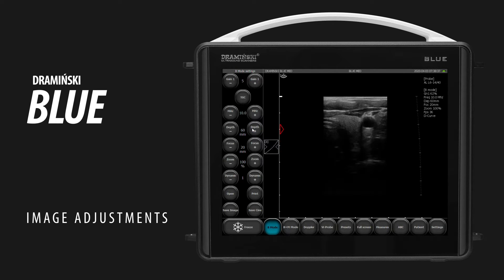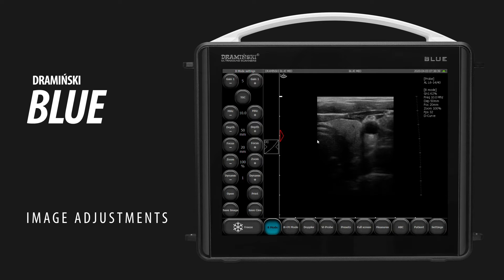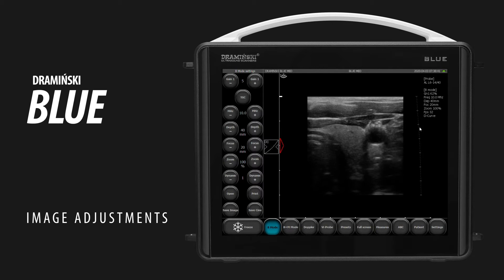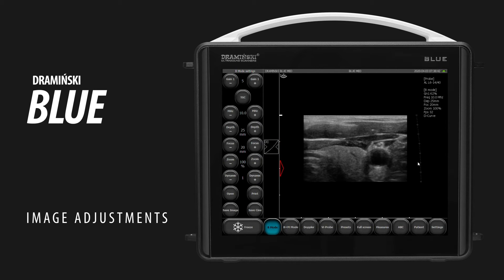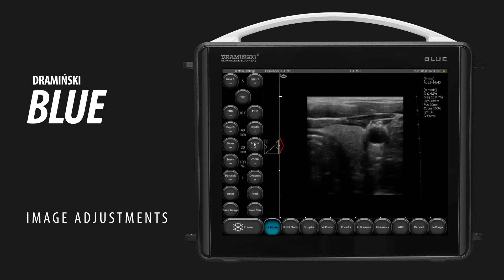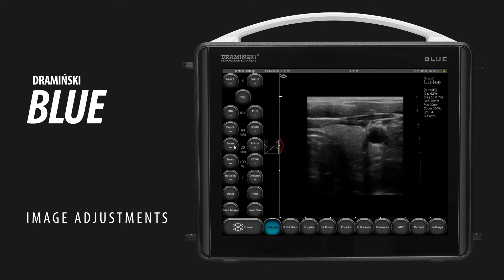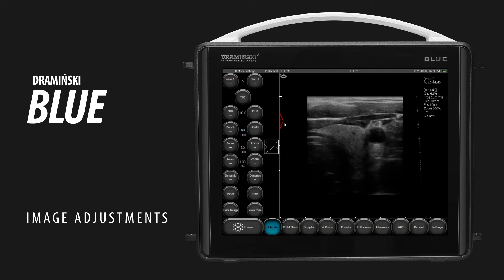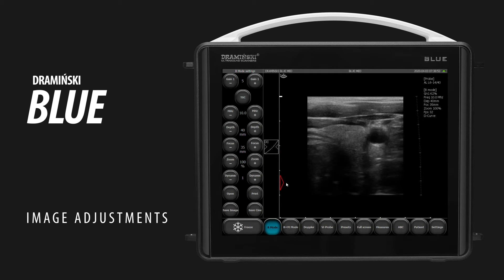To adjust depth of scanning, use the depth fields or the active field located on the right side of the screen. To adjust focus, use the focus fields or the active field on the left side of the screen.